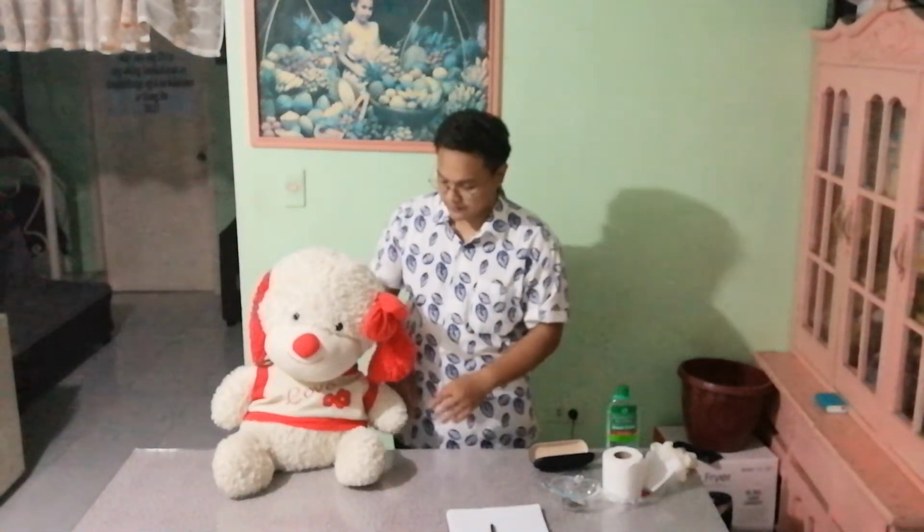Now we will proceed to assessing the axillary temperature. The first thing we need to do is, again, place the bed in an appropriate working height. So again, we will assume that we have already adjusted the bed. Now we will move on to the second step, which is we need to move the patient's clothes to only expose his or her axilla.